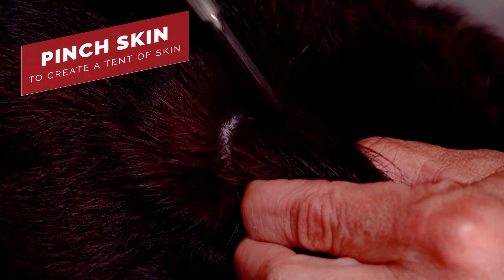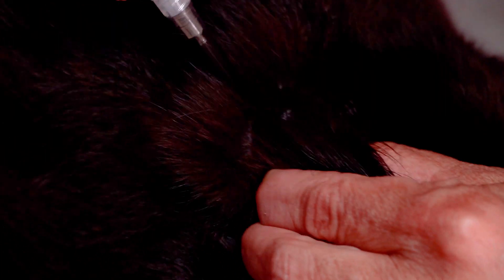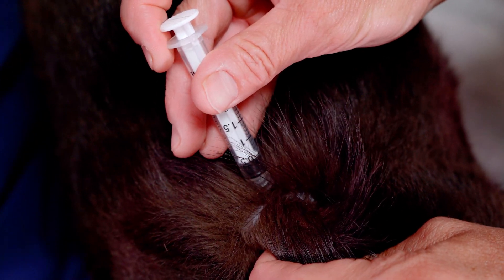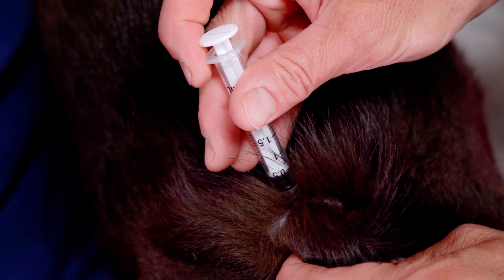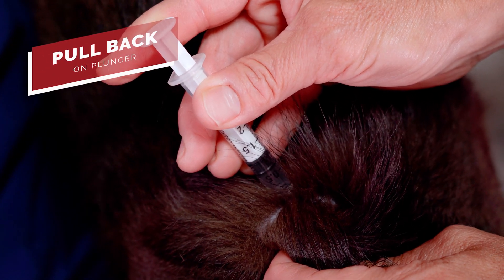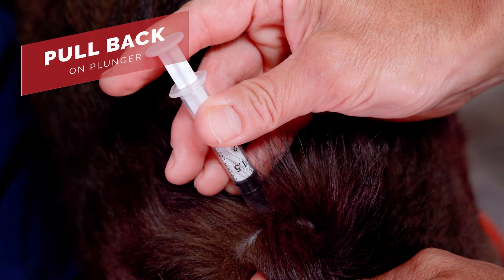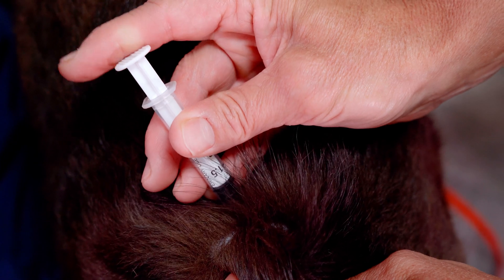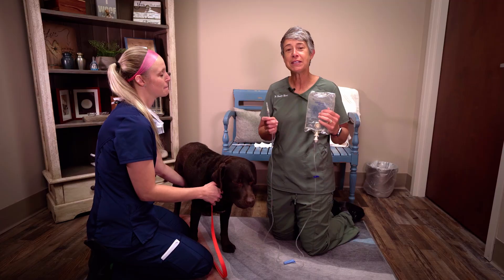We pinch the skin and create a tent of skin — you can see this triangle here, that's a tent of skin. The needle is then going to be inserted at a 45-degree angle at the base of the tent. Once inserted, you pull back on the plunger to make sure you have suction. That negative pressure tells us we're not in a vessel, and as long as you have negative pressure on that syringe, go ahead and deliver your medication.